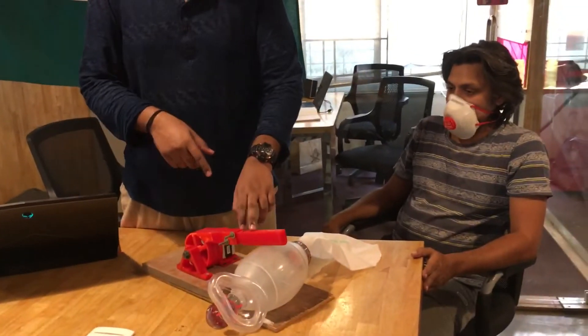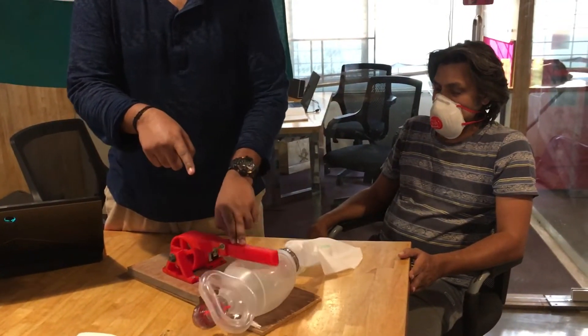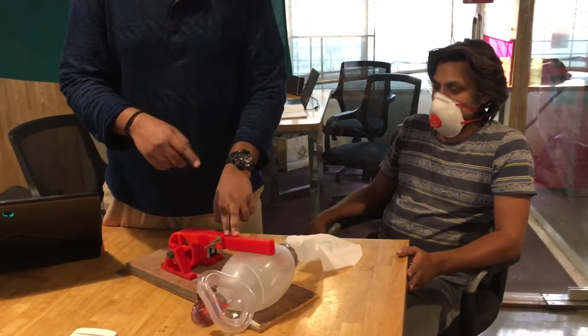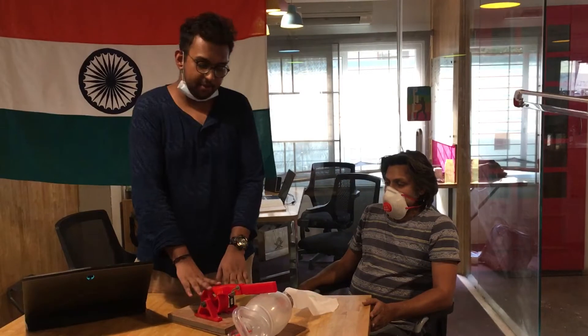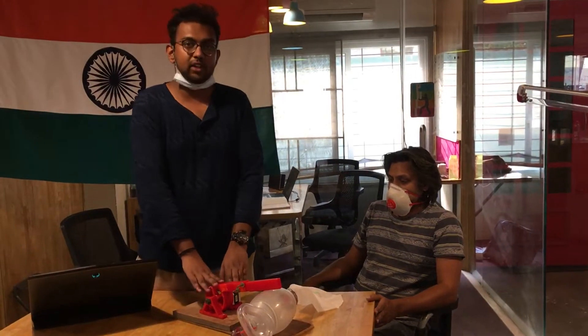Some of the parameters we are trying to control are tidal volume and tidal frequency. Tidal volume is the volume of air that the patient receives, and tidal frequency is the number of breaths per minute. For an older person it would be about 8 to 10 breaths per minute, whereas for more critical cases the machine can support up to 30 to 40 breaths per minute depending on your microprocessor's capacity.